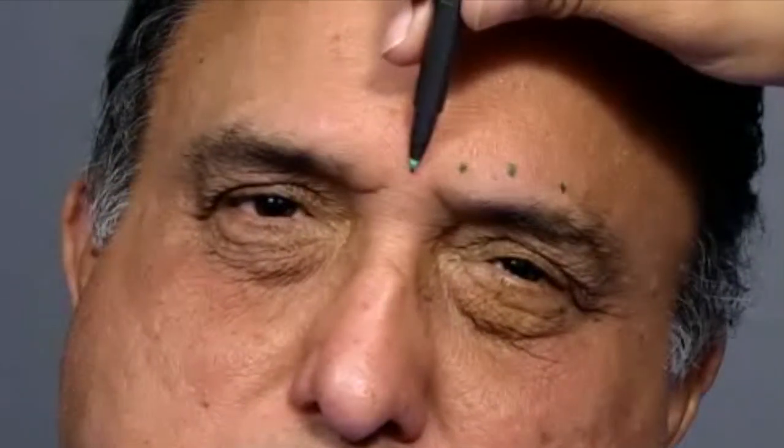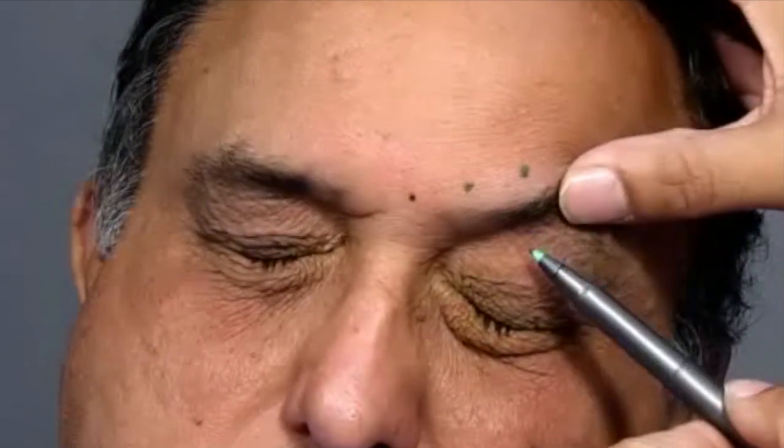Also avoid the extreme corners of the brow, which are closer to the lacrimal gland and might induce dry eye. The same injection pattern is repeated on the other side, and in addition you can have one central injection into the procerus muscle. Avoid the preseptal region and the sub-brow region, as that is closer to the levator muscle and can cause ptosis.